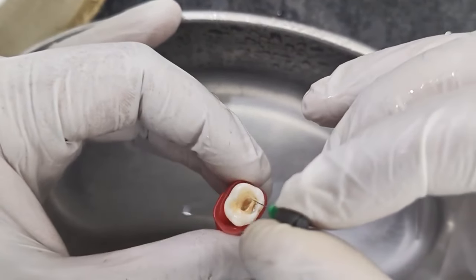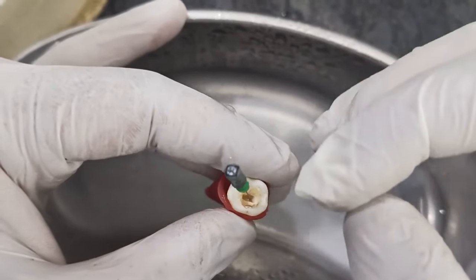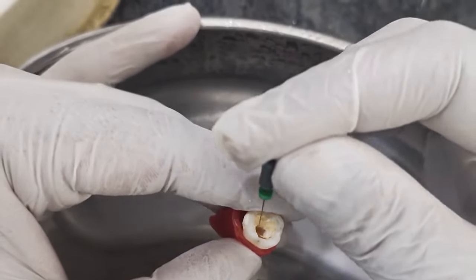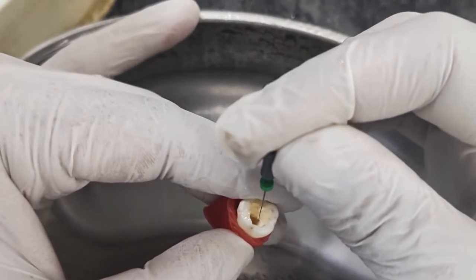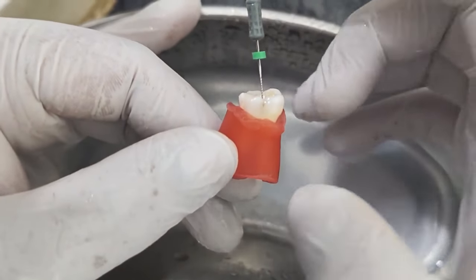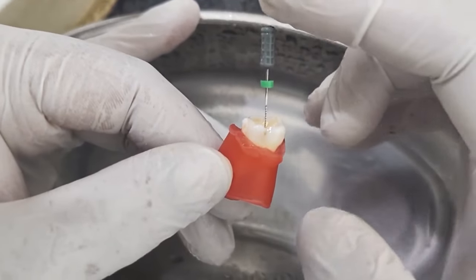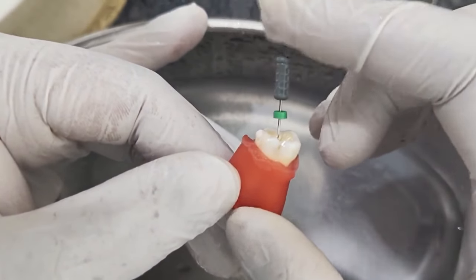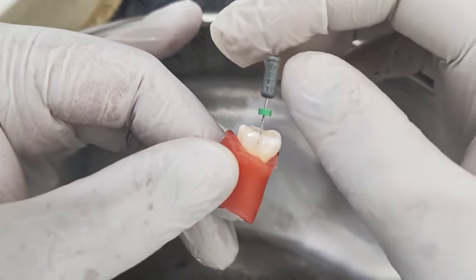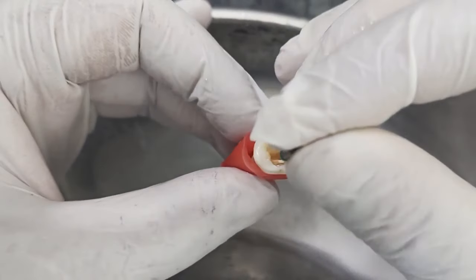Now next is the mesolingual canal. So this is the mesolingual canal. You can see it is just adjacent to the mesobuccal canal. So I am just putting it in the mesobuccal. This is the mesobuccal. You can see here the angulation. The angulation is not like this or like this, it's at a particular angle. So this is the mesobuccal canal, and for each and every file you are going to do the filing or rotary endo in the same direction. Similarly for the mesolingual, I will show you once again.